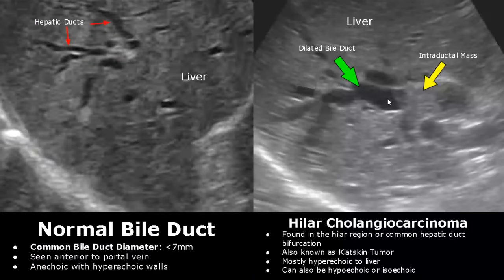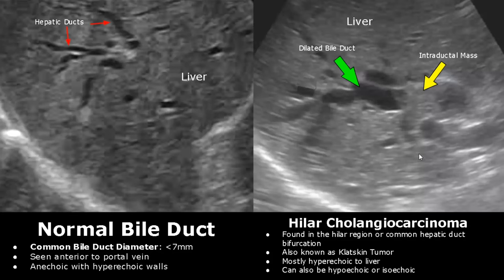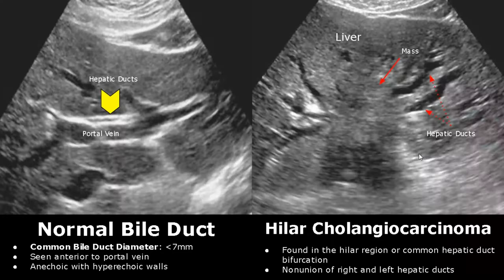Hilar cholangiocarcinoma is also called the Klatskin tumor. It is found in the hilar region of the liver as well as around the common hepatic duct bifurcation. The mass is mostly hyperechoic but can sometimes be hypoechoic or isoechoic. In this image we can see both the right and left hepatic ducts, but they are not continuing to form the common hepatic duct because the mass has occupied this region — this is called non-union of the right and left hepatic ducts, and this feature is helpful in diagnosing hilar cholangiocarcinoma.